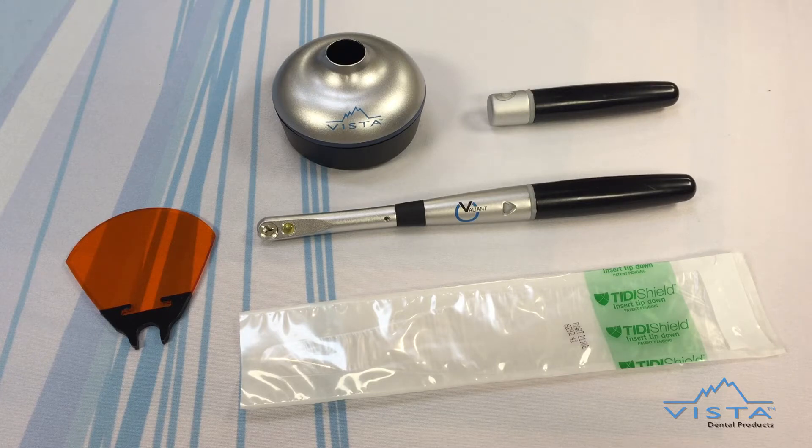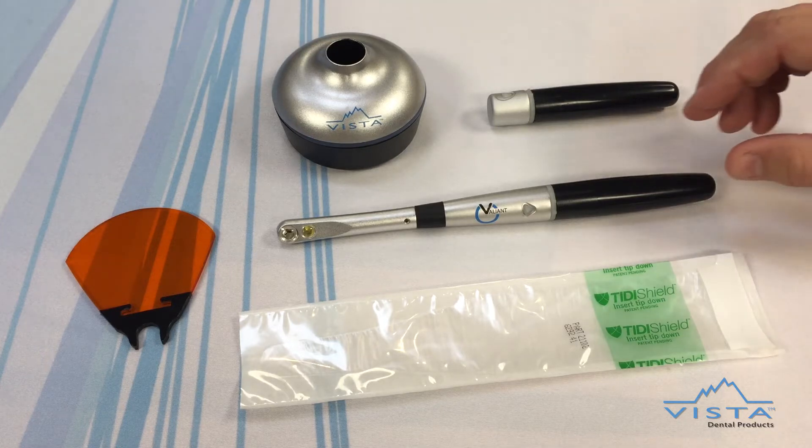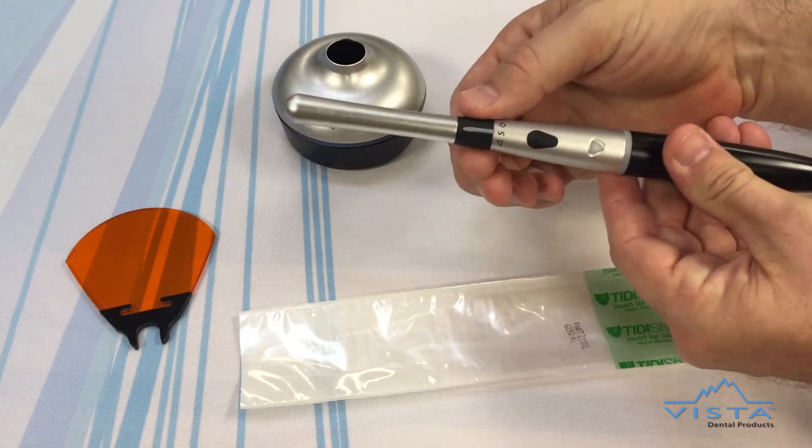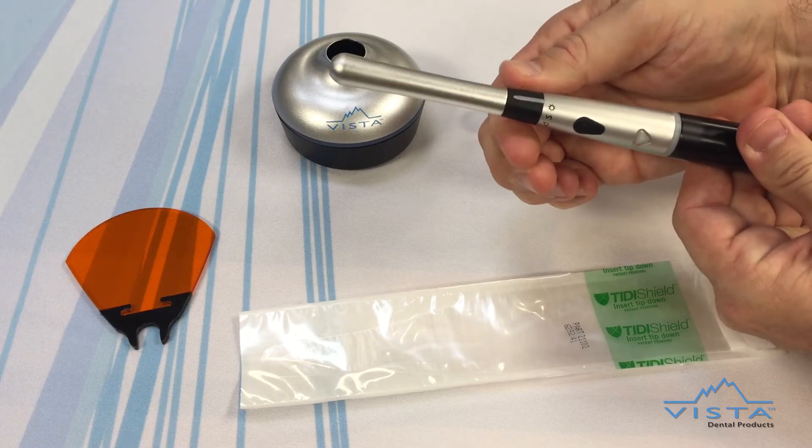Making it one of the most versatile curing lights on the market. The Valiant combines an optimized clover-shaped LED arrangement with precision optics to provide a uniform beam through three curing modes: standard, ramp, and boost.